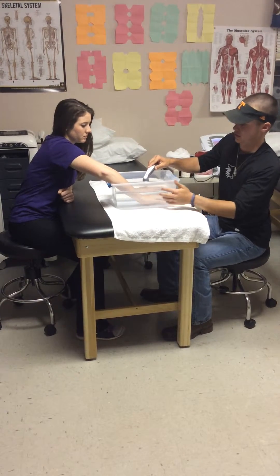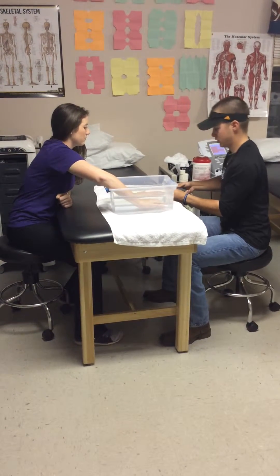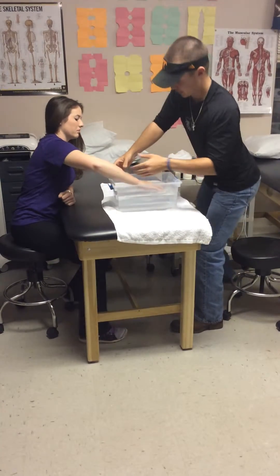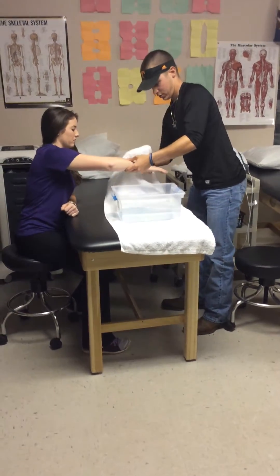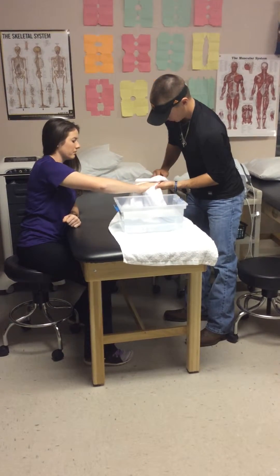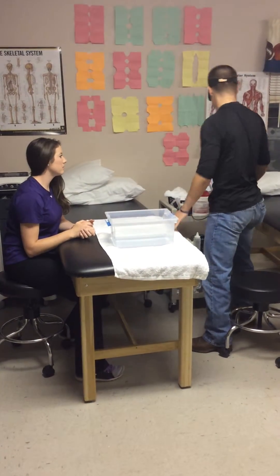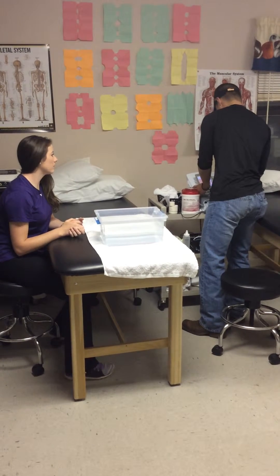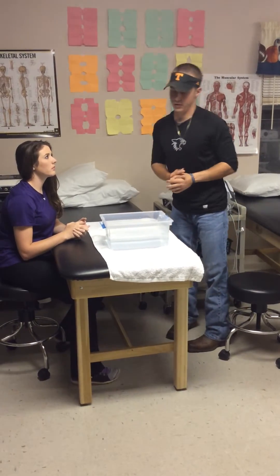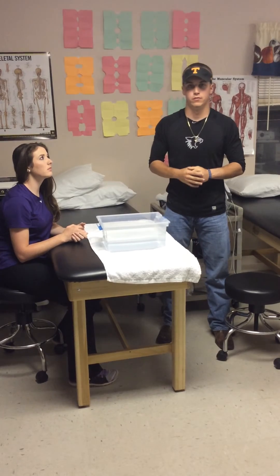After that, I will take the ultrasound head out and clean it off, then place it back. I'll move her hand out and clean the patient off. Then I will turn the ultrasound off. After that, I will document the treatment appropriately, and that is how we perform underwater ultrasound.